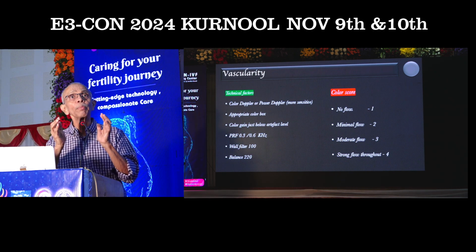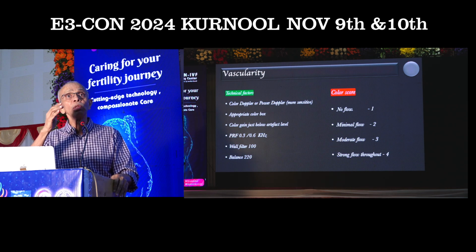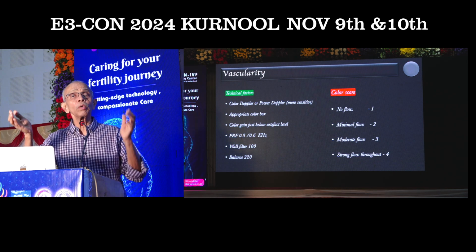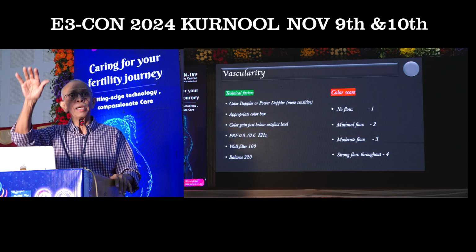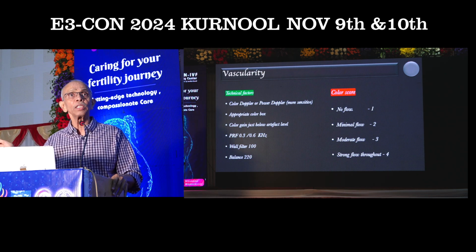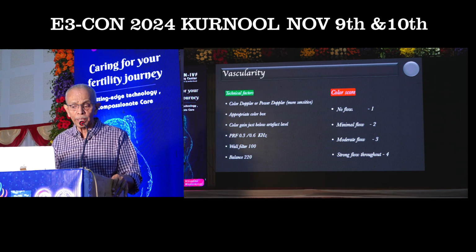The color box should be appropriate, because if the color box is appropriate, the frame rates will be maintained. If you use a large color box, that means you are asking the machine to work more. If it works more, the frame rates drop down, so your visualization of the vascularity will become very poor. That is the reason why you need to have an appropriate color box.